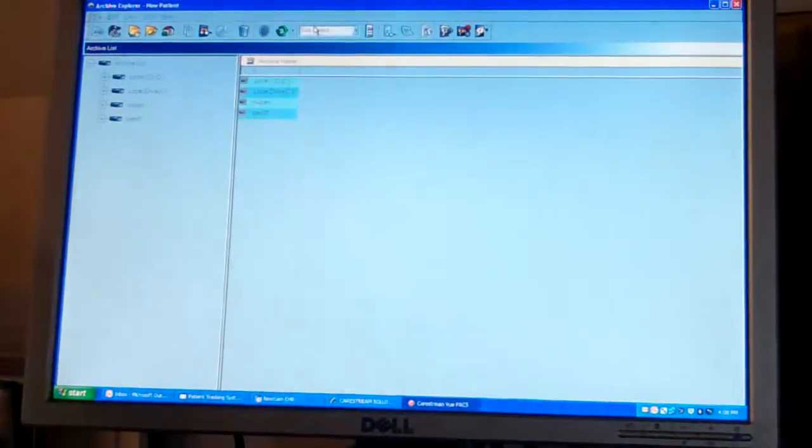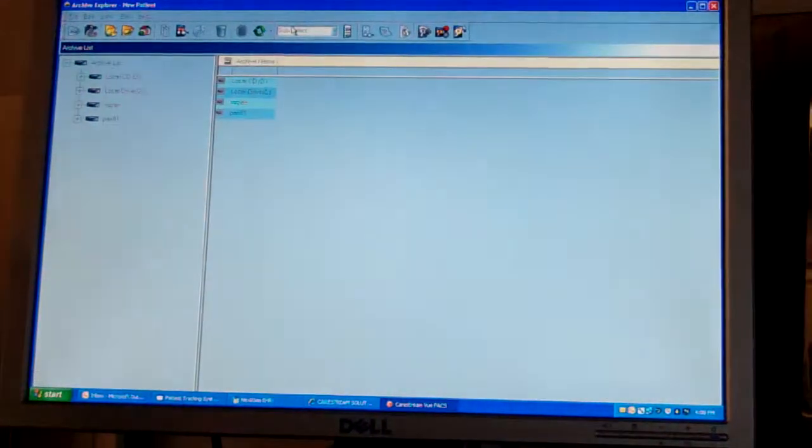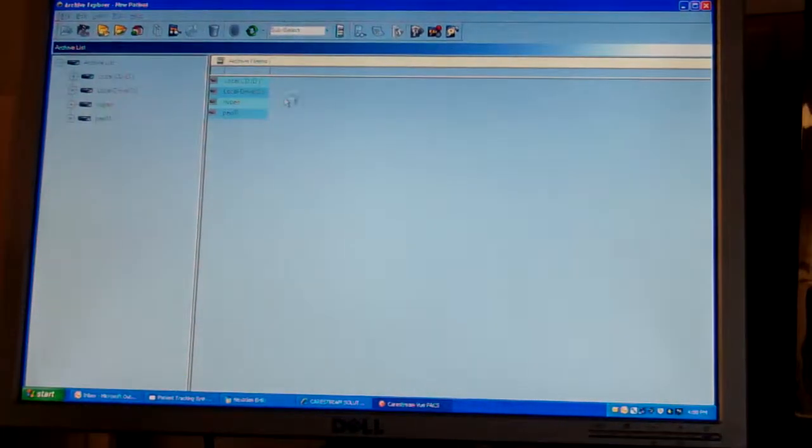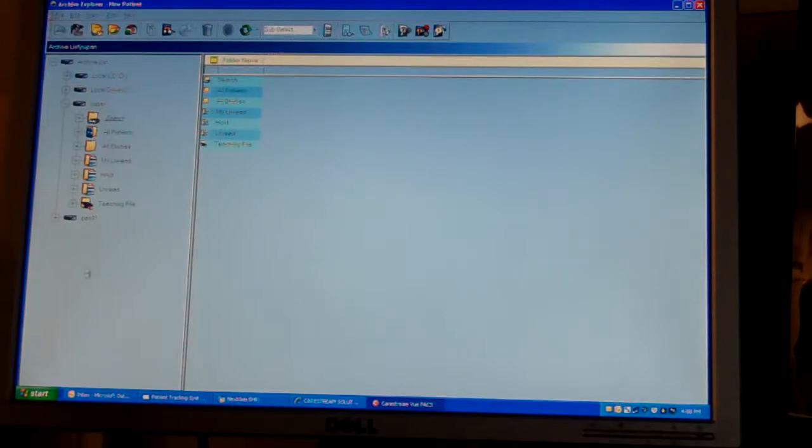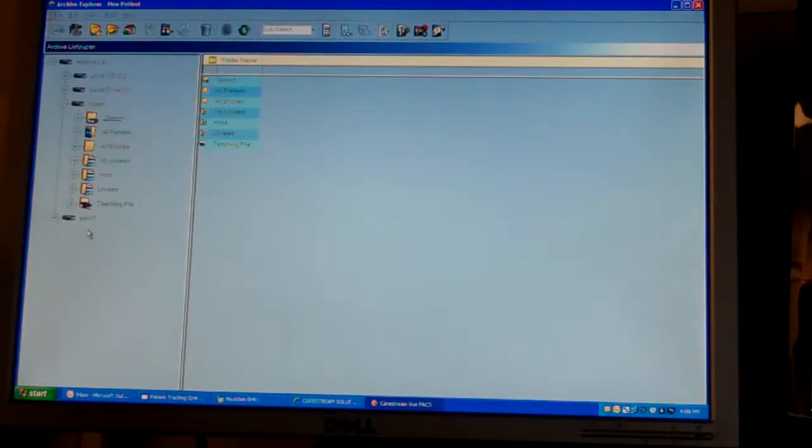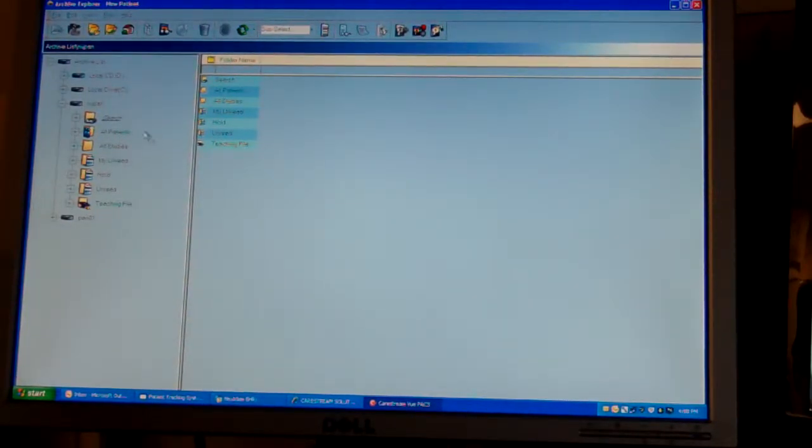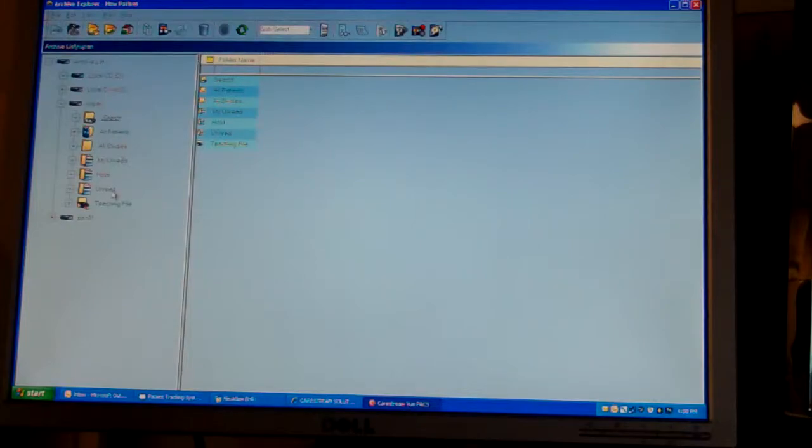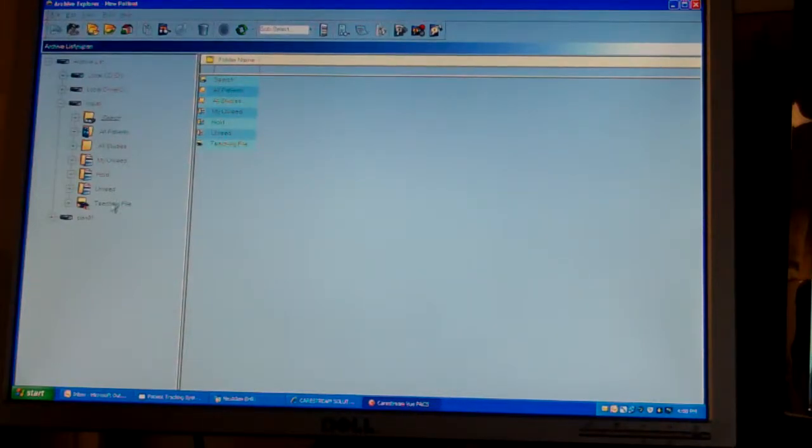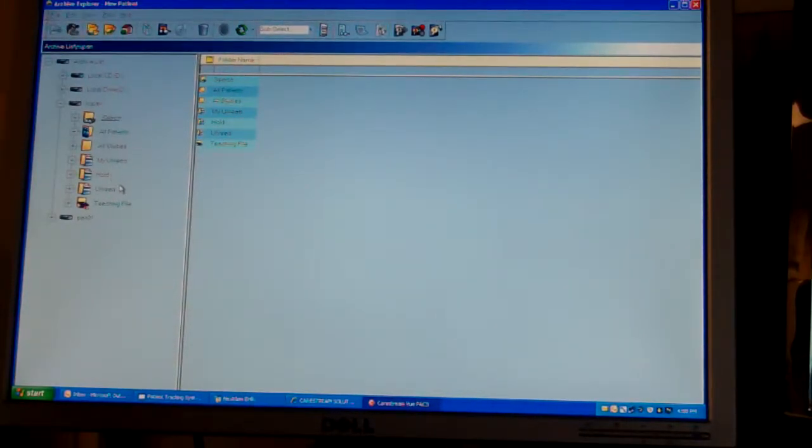You're going to start with the Archive Explorer screen. NewPan and NewPan2 will be the new servers we're going to use. Search, all patients, all studies, unread, and teaching file are all going to appear as they did before.